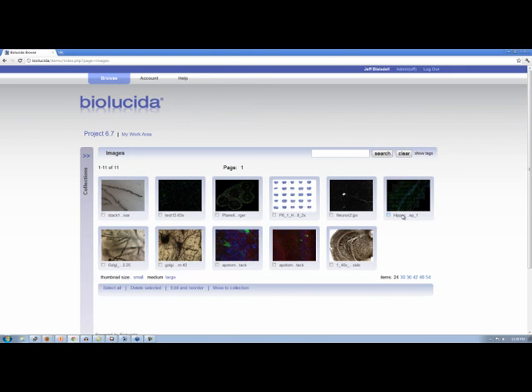And what you're saying here, this is a very important point to many of our users, is that since I haven't been given access to that collection, I won't even know it exists. So when I create a new collection and upload images to it, I don't have to worry that this is now going to be publicly accessible to everyone. Right? Exactly. Even the name of that collection, unless you give them rights to do it, they won't be able to see it at all. Excellent. Now, let's say, for example, with this, we wanted to give you view rights to see that collection.